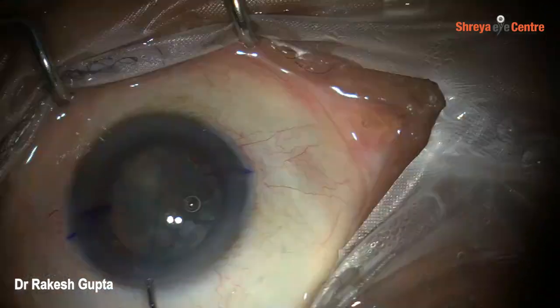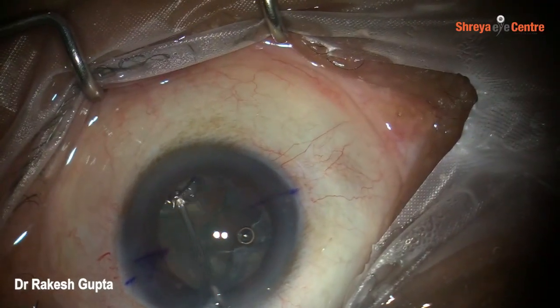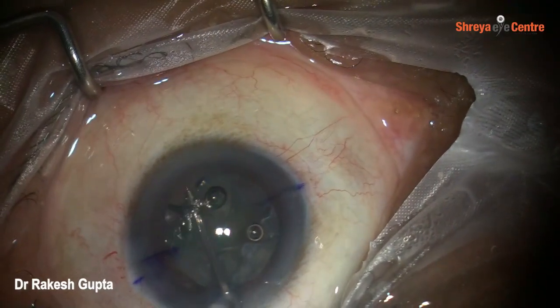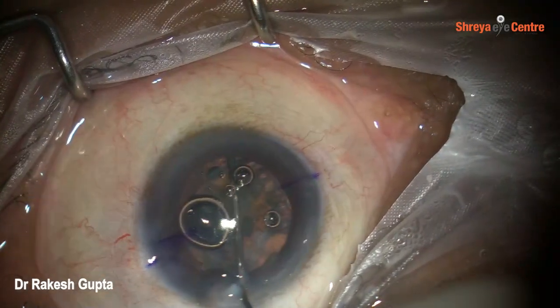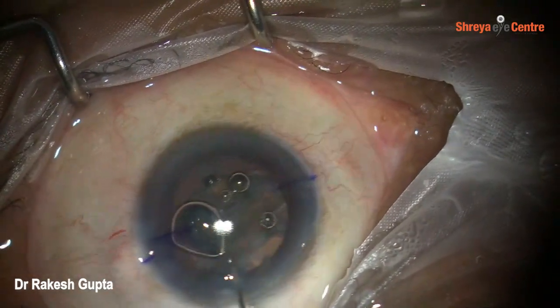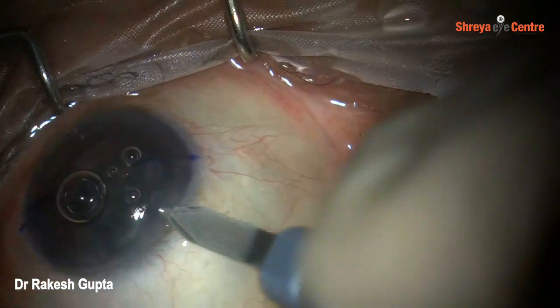So you can see I am injecting Viscoat, that is a dispersive viscoelastic having sodium hyaluronate and chondroitin sulfate, under the capsulotomy, the way we do hydrodissection, to put a layer of Viscoat behind the corticonuclear plate, and you can see that the infratemporal cortex and plate has been levitated above and towards the center.